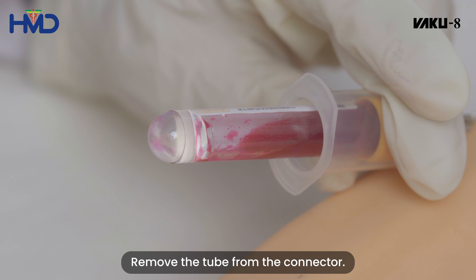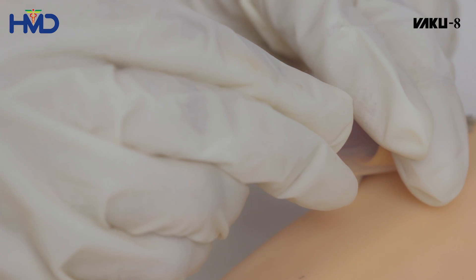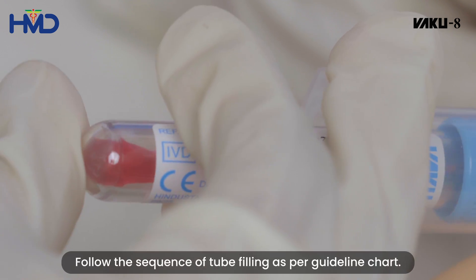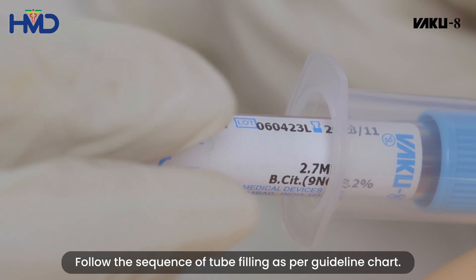Remove the tube from the connector and add another tube for multiple collections. Follow the sequence of tube filling as per the guideline chart.